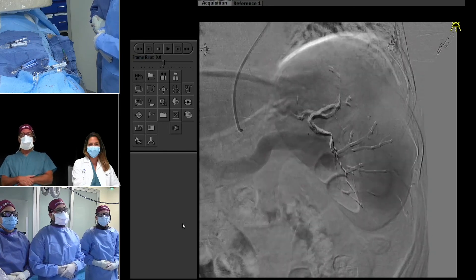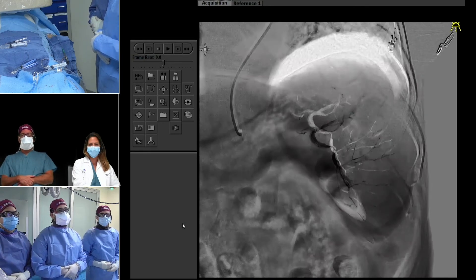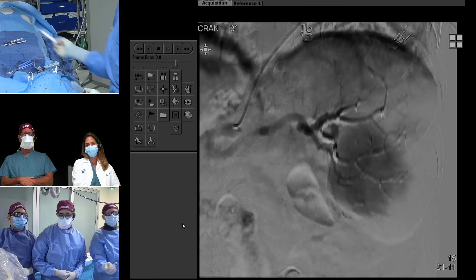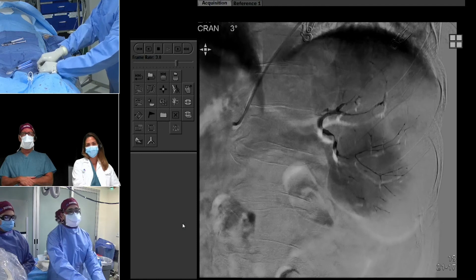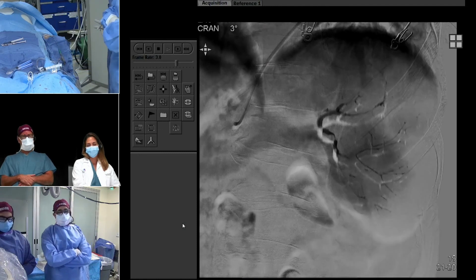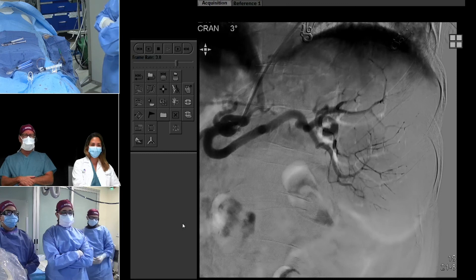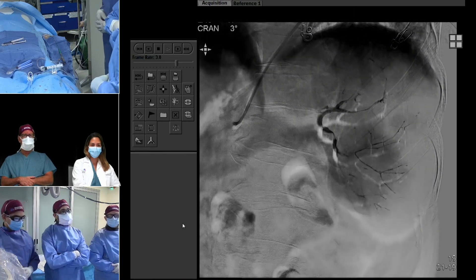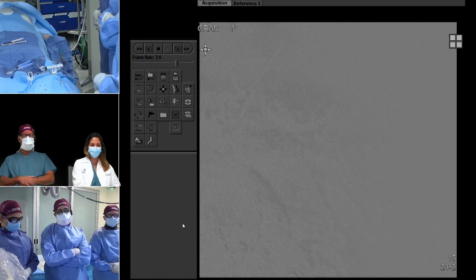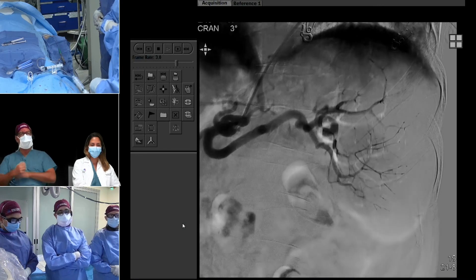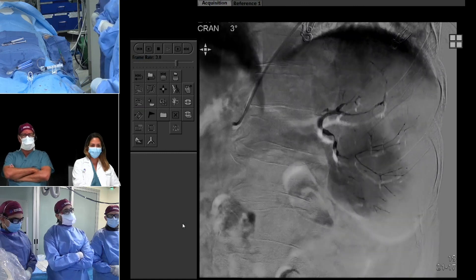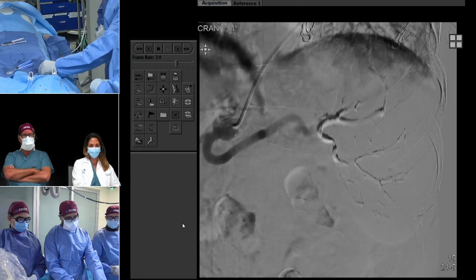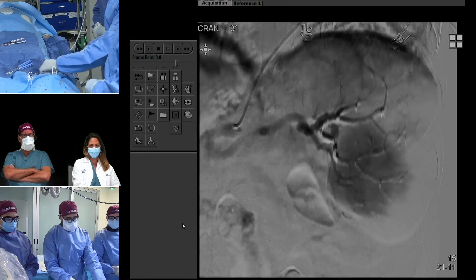It's a little bit more upper pole than I wanted, but it's still majority sort of posterior. Radials are a great option because we don't have to give them platelets or worry about their transfusion. We've done radial access in patients with very, very low platelets and can always give them platelets on the back end. We've published about giving patients who are on Coumadin, fully anticoagulated, with elevated INR from liver disease. We really haven't been transfusing on the front end — we've been correcting it on the back end as needed, and it's pretty rare that we actually need to correct it.